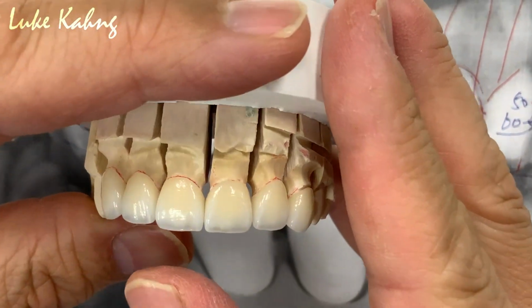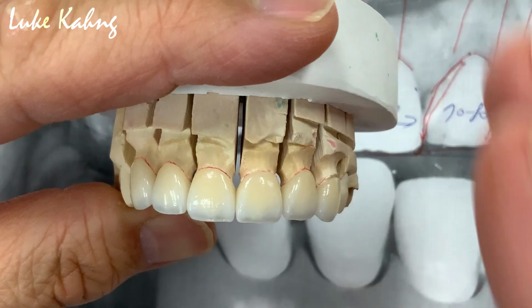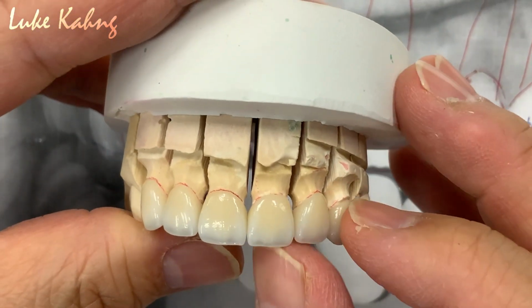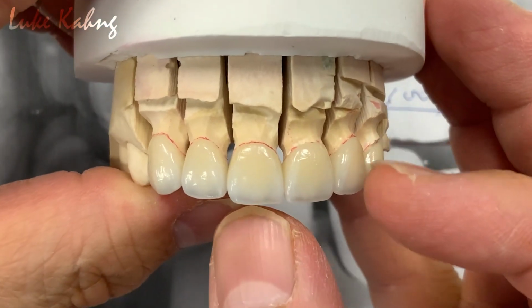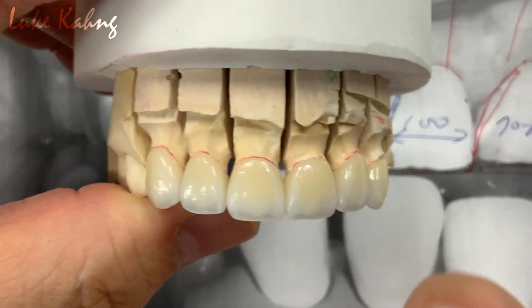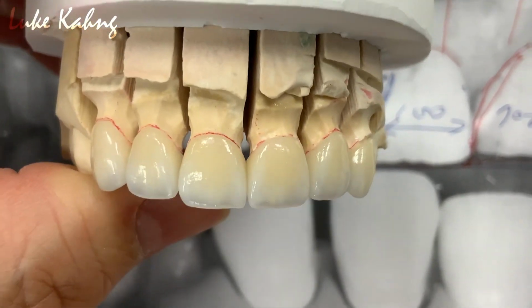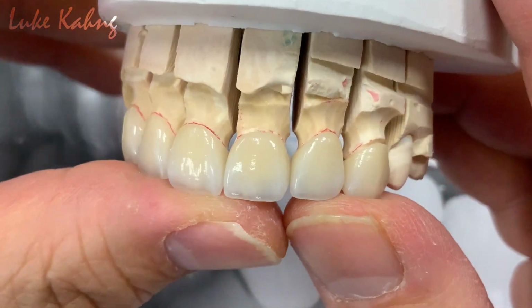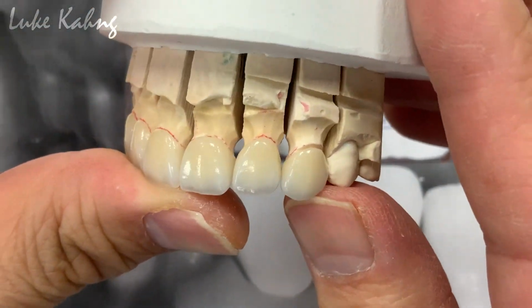I utilize more of the deep translucency, using TMO1, EOP4, TMO3, and then it's a good halo in between the teeth. Just like a lifelike restoration, it's not like a shade tab, it's more like natural dentition with the enamel.